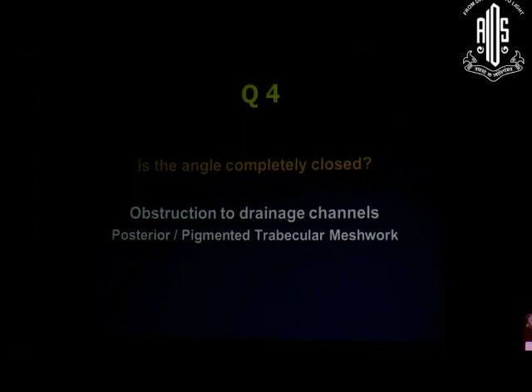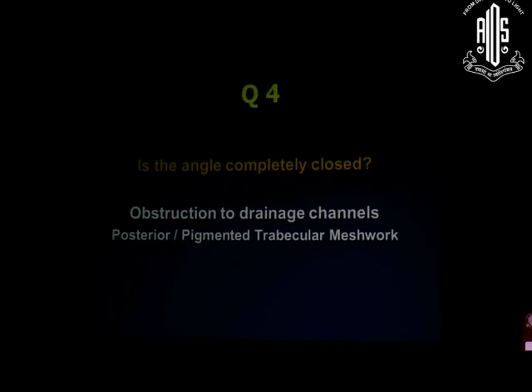As the disease progresses, when you put in a gonioscope, just remember the first video where you could see the scleral spur and trabecular meshwork. Here you see only the iris and the cornea — no angle structure is visible. This is the hallmark of primary angle closure glaucoma: complete angle closure including all angle structures, no drainage, causing a secondary rise in intraocular pressure. Another patient with a completely closed angle and a very convex iris — this is the hallmark of synechial angle closure in primary angle closure glaucoma.